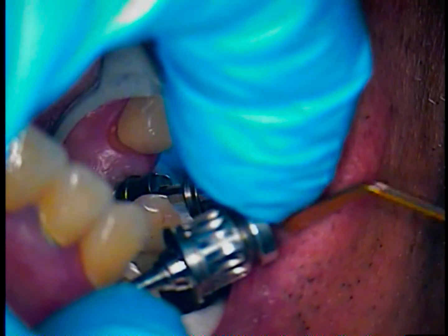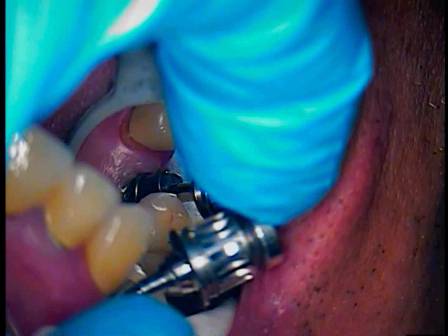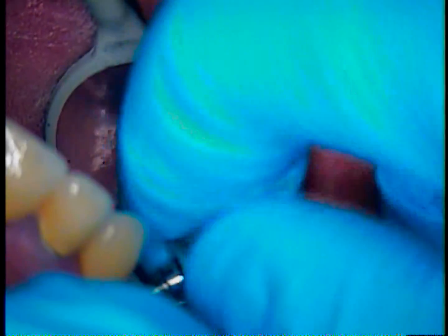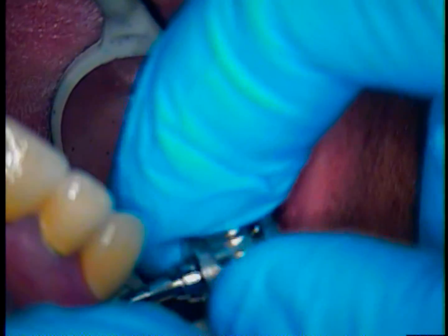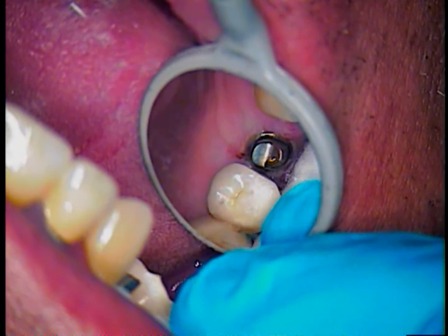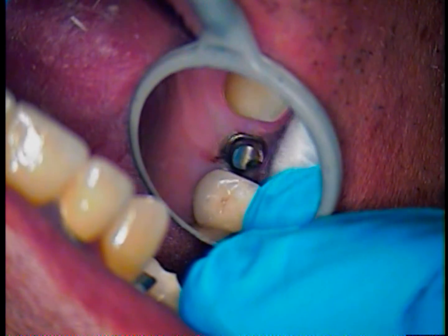My dental assistant just pulled the actual mirror out of my hand — sometimes I don't even know it's in my hand with my fingers working. Holding it in place — it's kind of confined in there, not a lot of room, and the visual is difficult for the viewer right now. But there's the angle. So the thing to do now is to look at the crown itself and see how it would line up. I'm just ever so lightly hand tightening the abutment in place. It looks angled and tight on the distal.